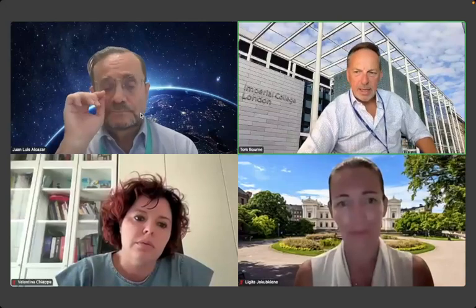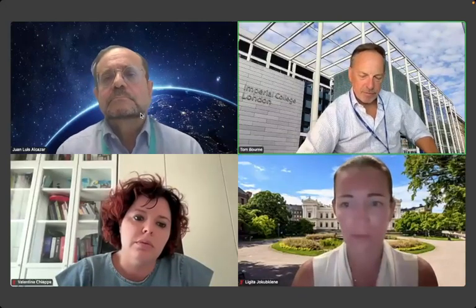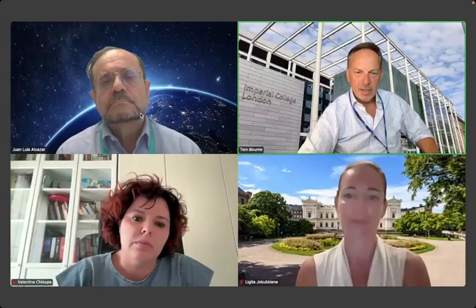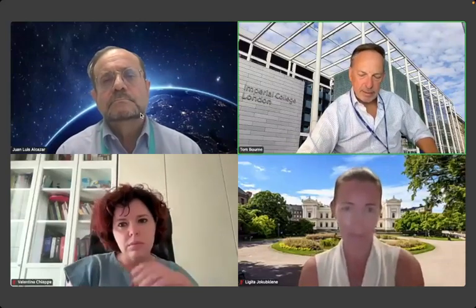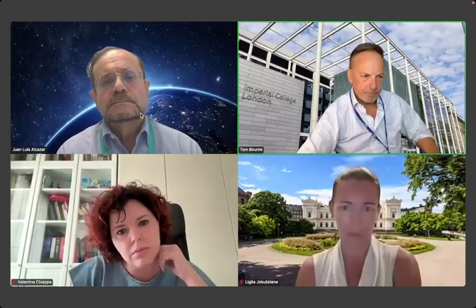First of all, just applying the IDEA consensus and so forth in the machine. You can see Ahmed's point where he says, well, it seemed to take a long time. However, surely the point is that you do a complete examination and it's there in front of you. So you're doing a demonstration scan, so obviously you're taking quite a long time to do it. But I feel that having it on the machine like that means that you really are applying the IDEA consensus in practice. I mean, what's your feeling about that?